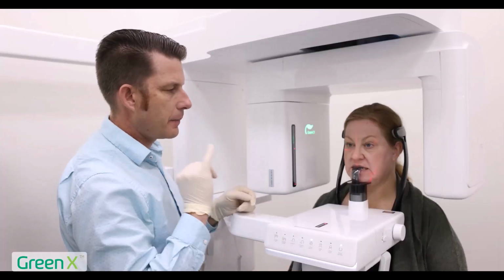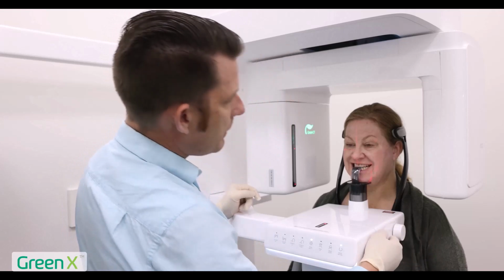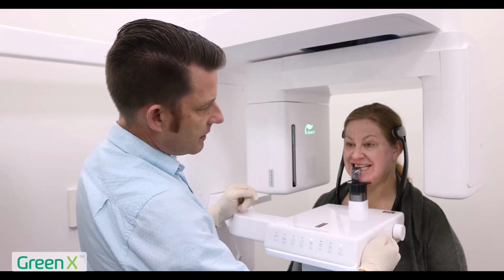Lastly, let's look at the canine beam. I'm going to line the canine beam up. Go ahead and smile really big for me, and we're going to line the canine beam up right to the center of the canine.